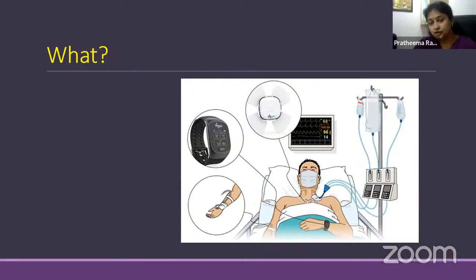Are the tubes working well? Is the tank getting filled, or is it half full? This is what the whole hemodynamic monitoring is about. If you look at just a glance, it is going to be static. We don't know whether it is moving, whether it is circulating properly.